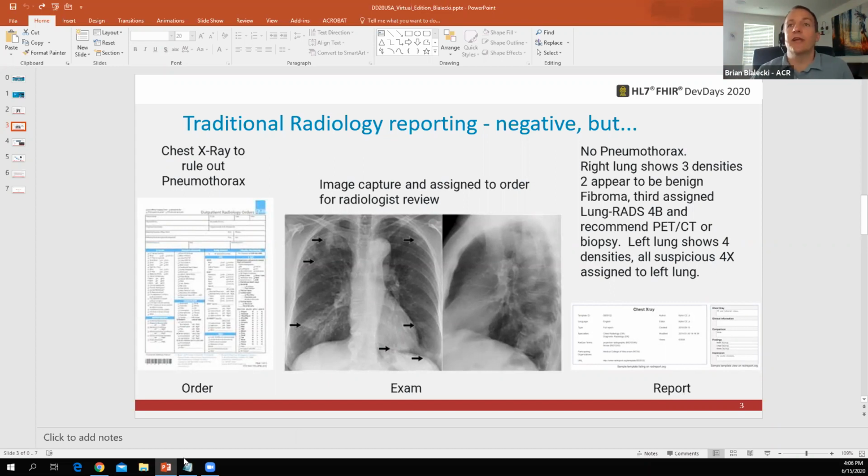I look at a liver and I see a bunch of lesions, or I look at a chest exam and I'm pointing out a bunch of areas, which specific item do I want to be biopsying? You don't want to have to do that more than one time with a patient. Right.